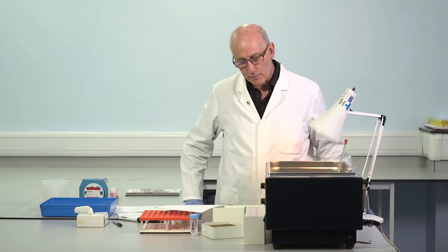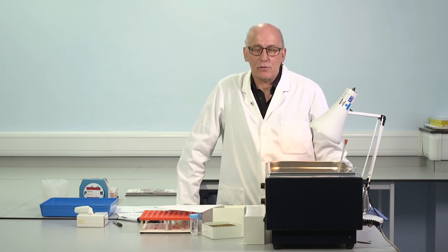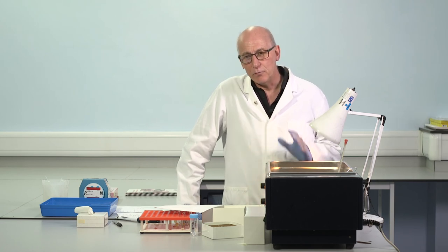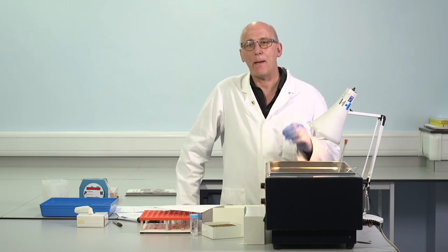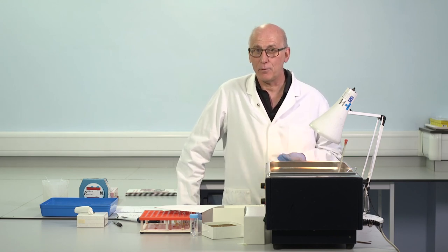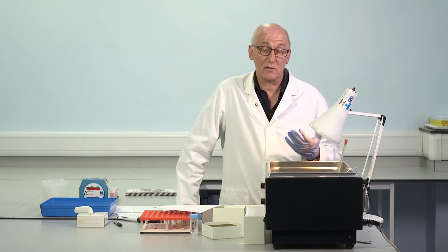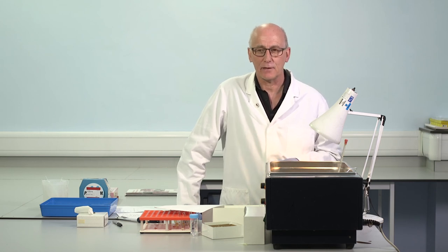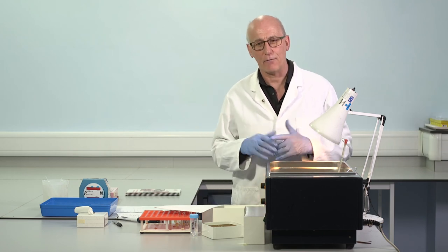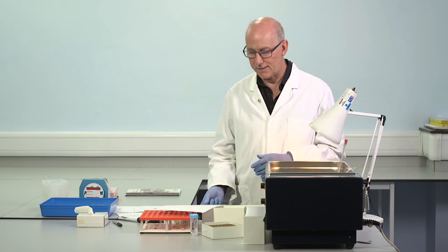If we are a centre who is using APTT for heparin dosage assessment, in addition to bleeding disorder work, and as I mentioned, that's I think very frequently the case for many of us, then we really must pay attention to the different heparin sensitivities. It's important to establish a reagent-specific therapeutic range, and there are publications and guidelines which advise us on how to do this. There's a UK guideline from BCSH, and there are international guidelines also in publications. So we have to keep in mind that we will expect to see very different therapeutic ranges according to different APTT reagents. So I think that's also important to keep in mind.